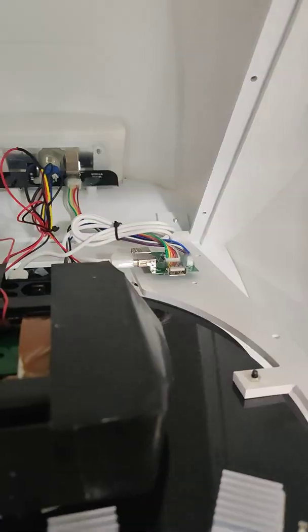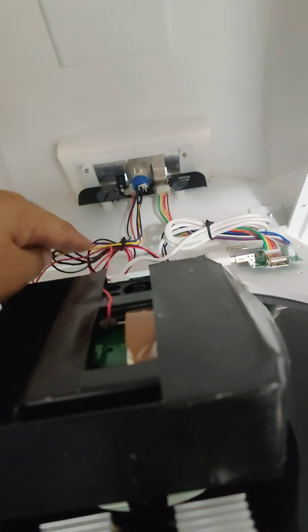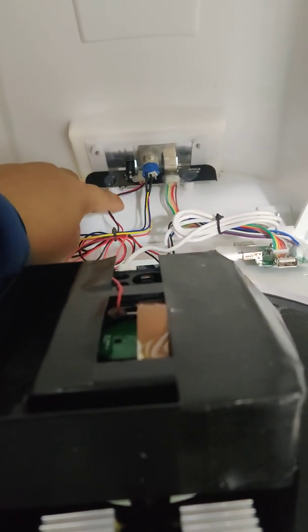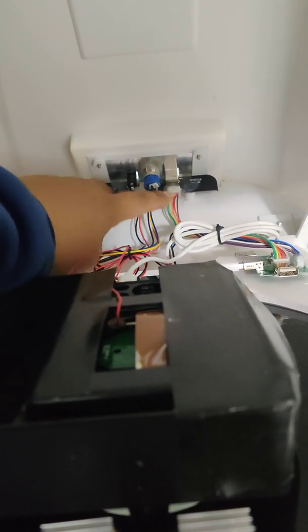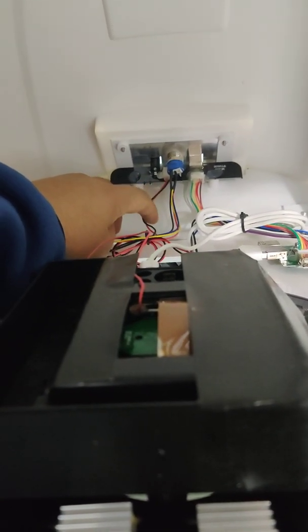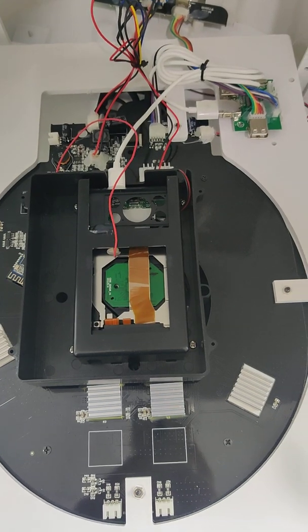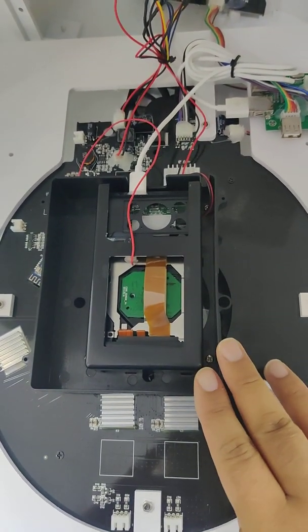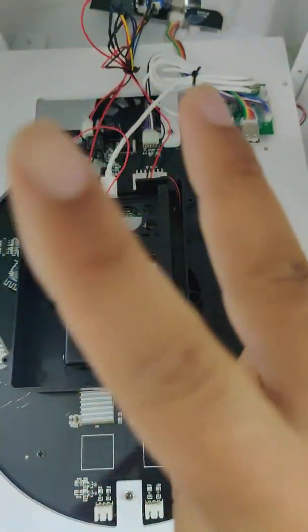Look, there are 3 cables we need to disconnect. 1, 2, and 3. Okay, 1, 2, 3. We need to dismantle these 3 cables. But first, we should take off the 2 tapes right here, the black tape. This and this one. Take off the 2 tapes.